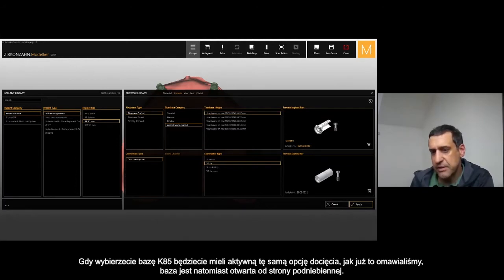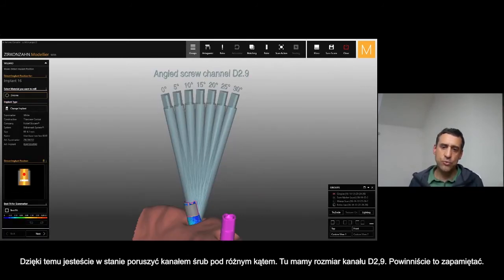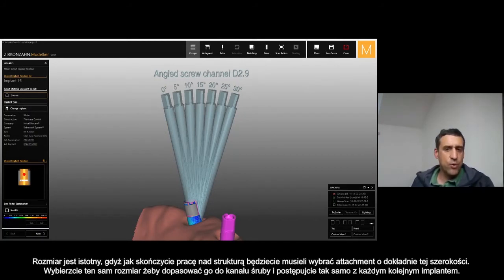Then you are able to move the channel screw with a different inclination. Here it is named 'angulate screw channel D2.9.' You have to remember this size — D2.9 — because once the framework is finished, in the attachment step you need to choose exactly this size so you can match the different inclination with the attachment to have the channel screw correctly.